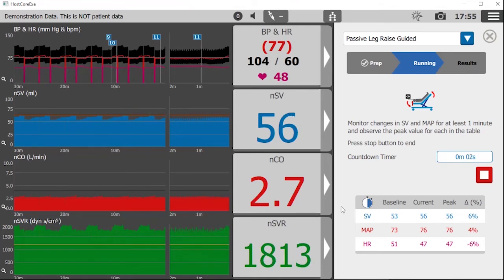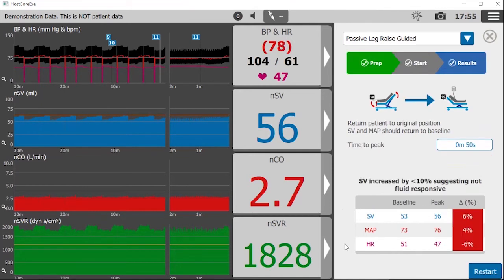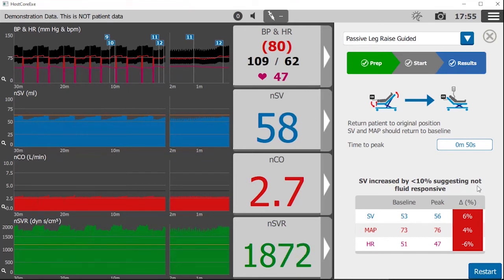The table at the bottom of the screen records the results. In this example, the patient does not appear to be fluid responsive since the change in stroke volume was only 6%. Results are highlighted with color and text for emphasis. From this menu we could restart the passive leg raise, perhaps with a 90 second hold time, or return to the main screen.